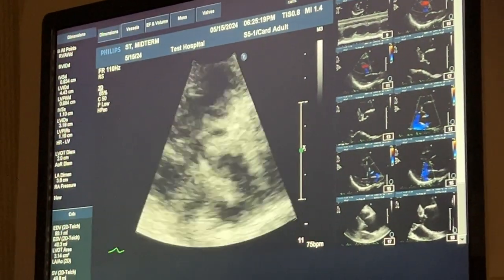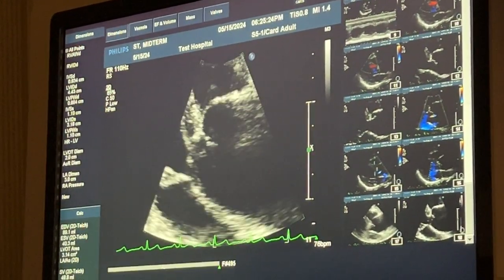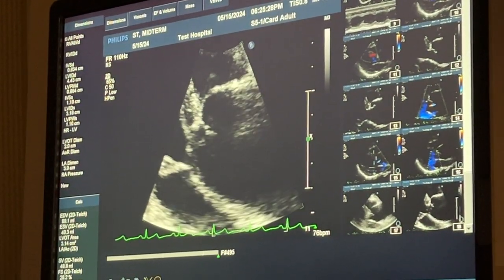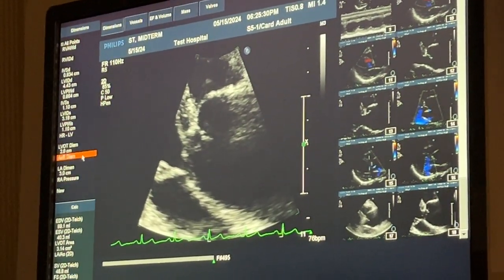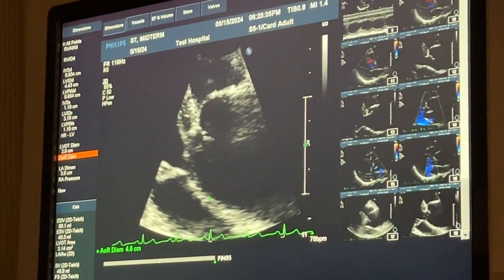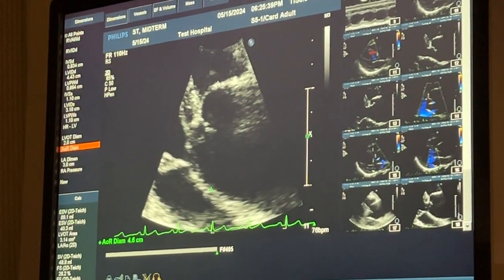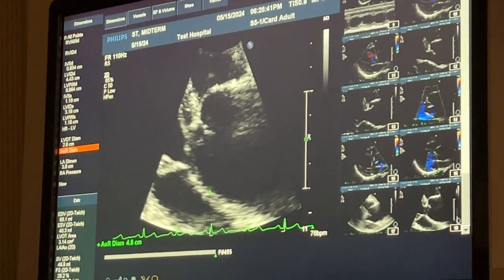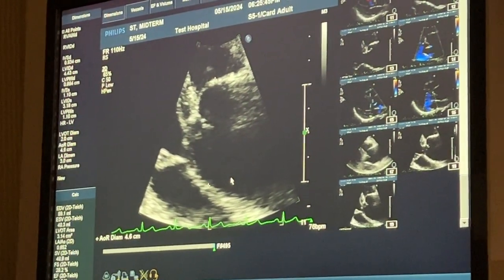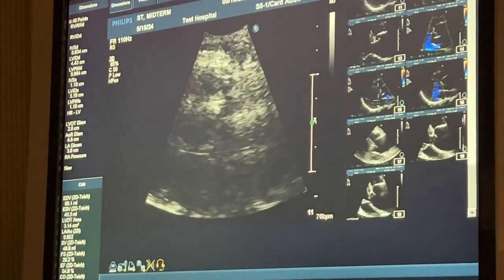I'm gonna try to. Okay. That's a really good spot. Beautiful. Okay. Going in with my caliper package. Aortic root diameter. Do you go outer edge to outer edge, or outer edge to inner edge? Outer edge to inner edge. And is that one dependent on the facility? Very much so, unfortunately. It's technically ASE guidelines, but some places follow old ASE guidelines or amended ASE guidelines, so it's something worth checking on.